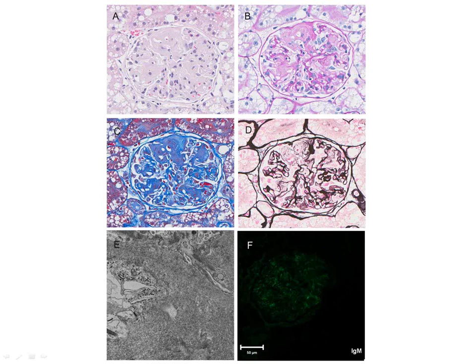And then I'm looking at the EM, and this is a pretty high mag, so I'm having a little bit of trouble orienting myself. I think at the very top, between 11:30 and 1, that's probably the uriniferous space. Yep. And then you have complete effacement of the processes. You can't even really distinguish them.